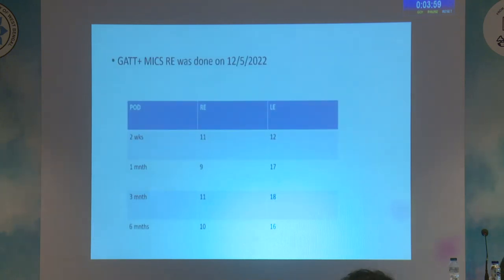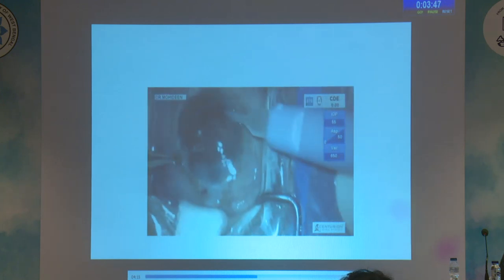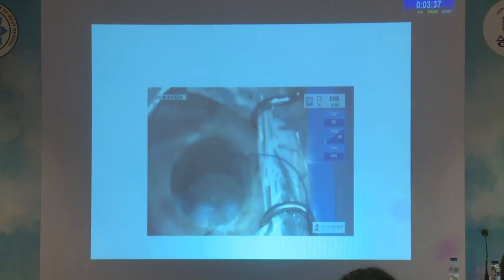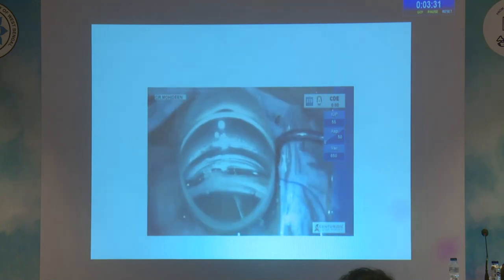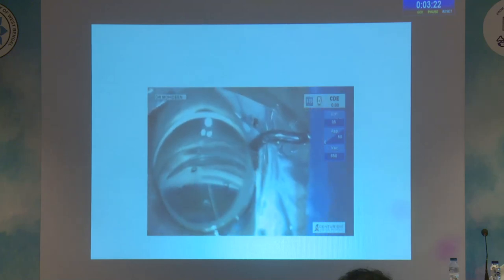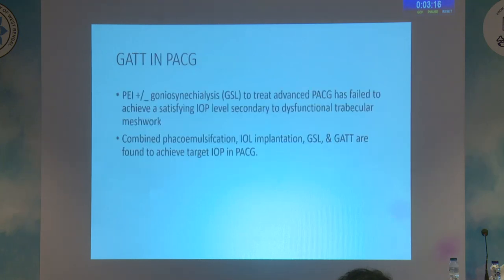This patient underwent gonioscopy assisted transluminal trabeculotomy with phacoemulsification in the right eye and the intraocular pressure control was really good in this patient. This is the video showing the GATT procedure being performed in the right eye of the patient. The patient had good control of intraocular pressure in both the eyes.